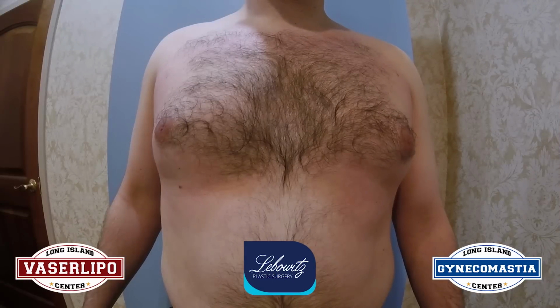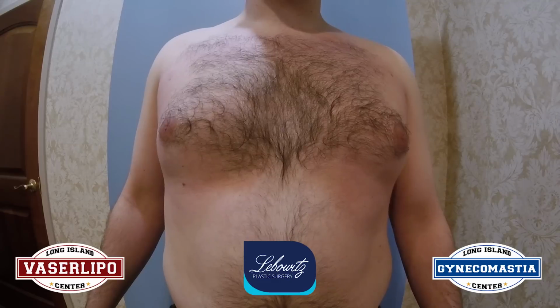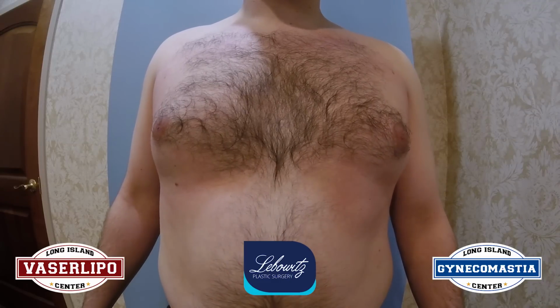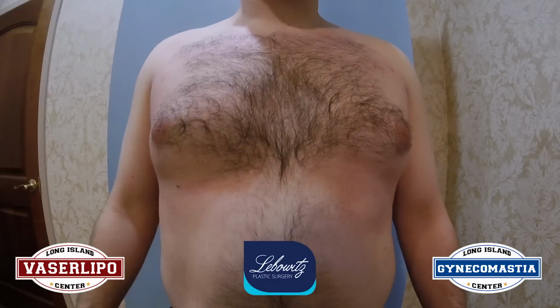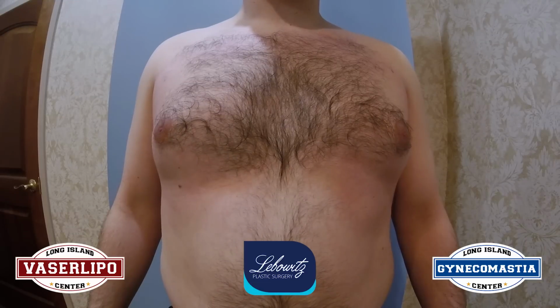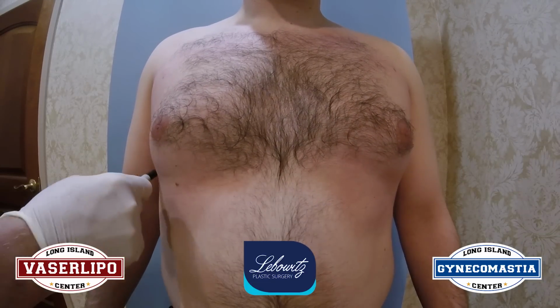So I'm going to show you my markings for the Vaser liposuction. This will be done under local anesthesia. He'll be awake, perfect results, because he's cooperative, and I'll turn him and twist him. He'll lift up his arm and down his arm so I can sculpt a high-definition physique for extraordinary results. So my markings are as follows.